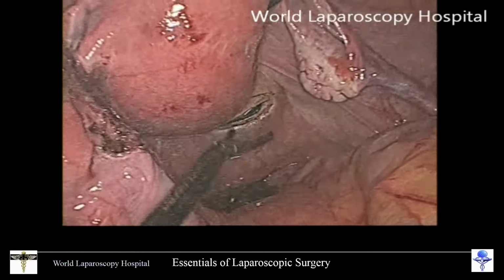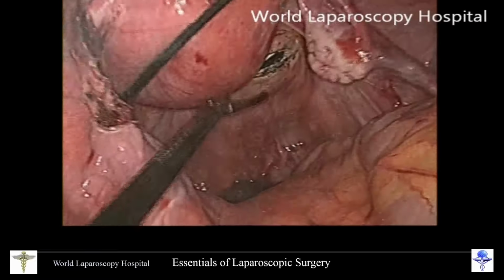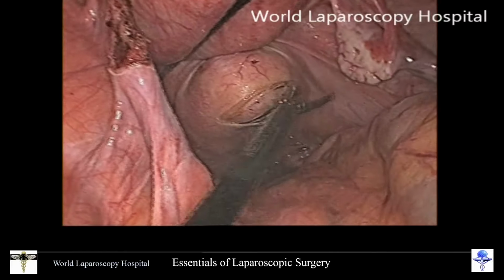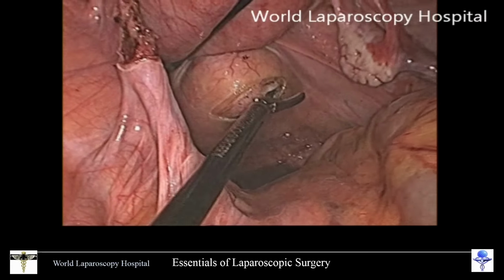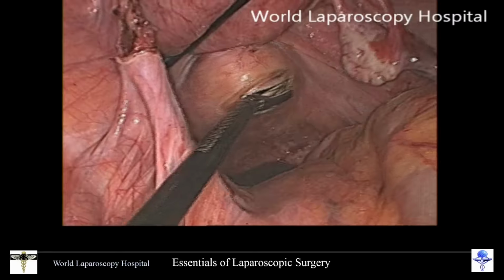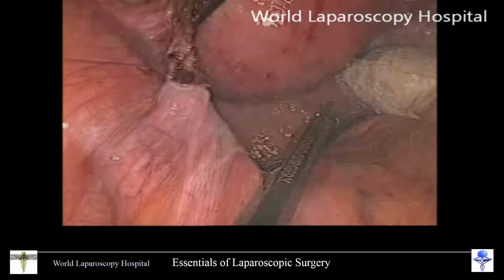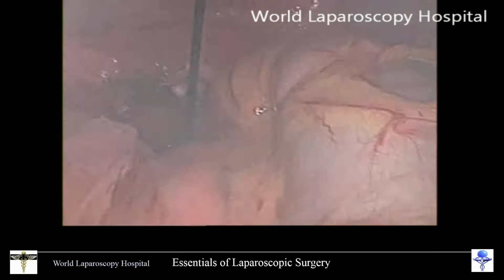After that, you should not cut beyond the uterosacral. You should always keep the uterosacral intact, and the proper distension is required by the sponge, and this is the vaginal epithelium which is cut. Then this is a sponge inside.